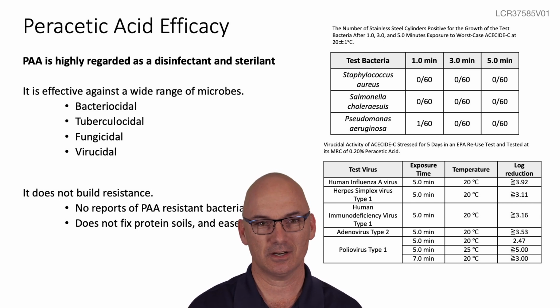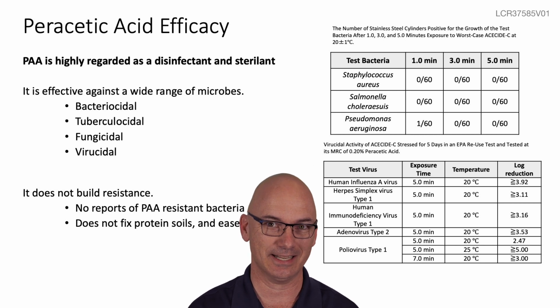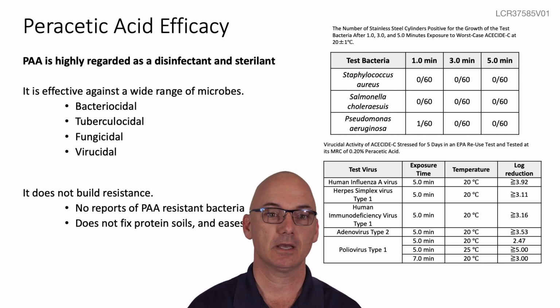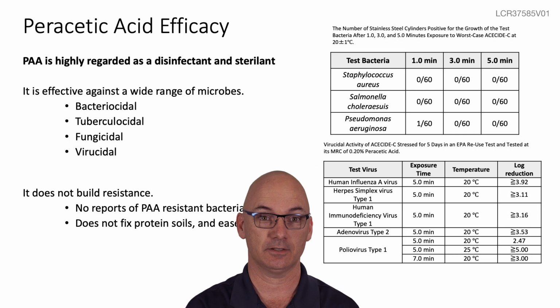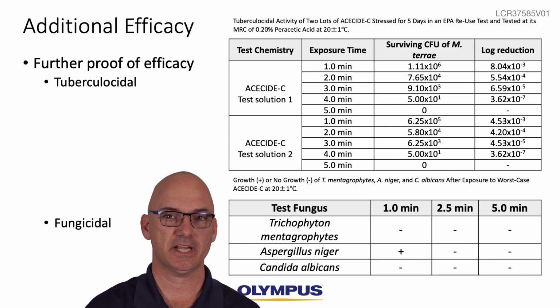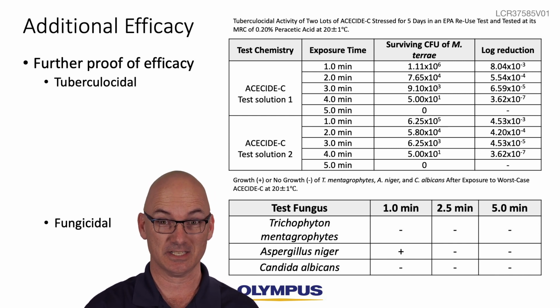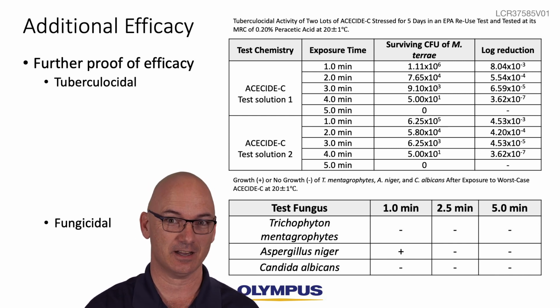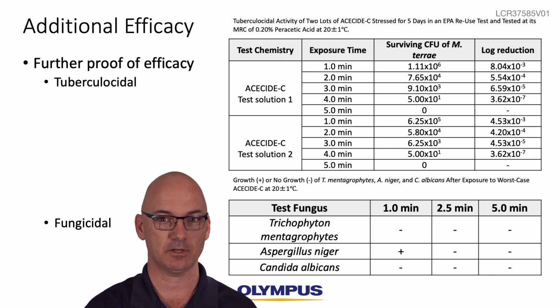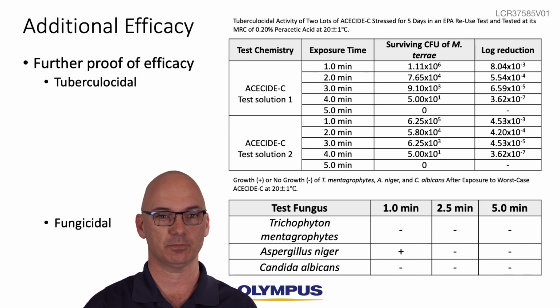You can see from these charts some of the relevant kill times and how long an exposure it takes to achieve that for both bacteria and viruses. You can see efficacy against a variety of other test organisms as well. The contact time for liquid chemical germicides is significantly increased over these contact times to ensure a wide safety margin. I do need to remind you, this is based on thorough and meticulous cleaning before the disinfection process.